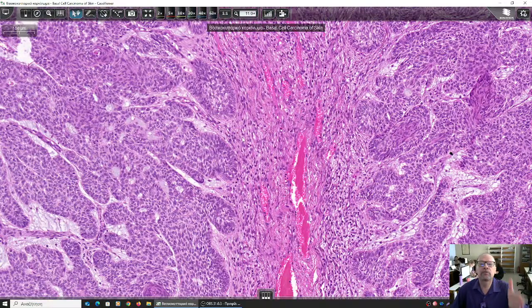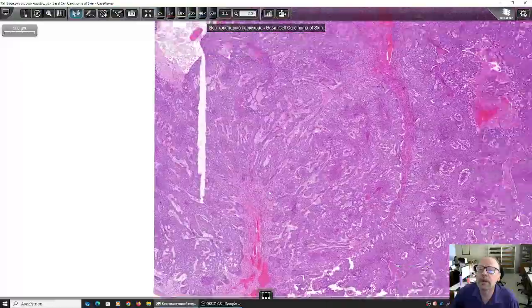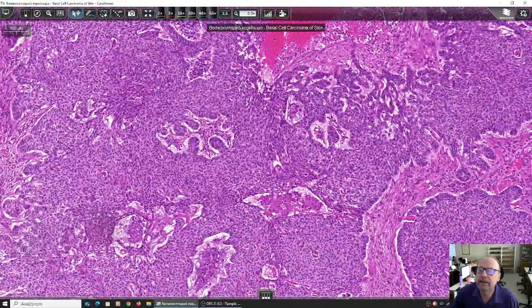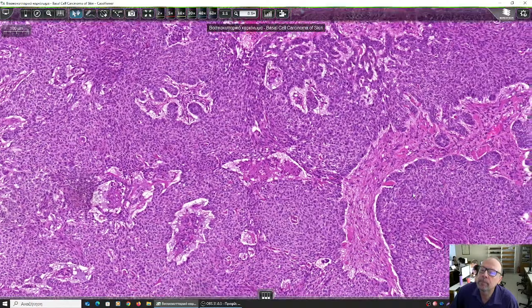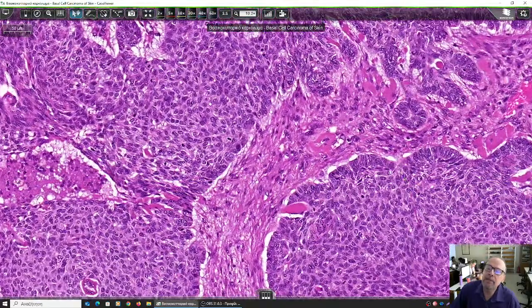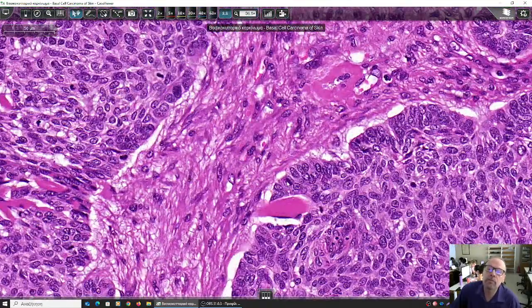They are some sort of stratified, one next to the other. Let me see where I can show that, and it will be clear. You see here? Here they are all mixed. No polarity is evident here, but here they appear to be one next to the other. And what do they do? What is this cell here? In which phase do we find it? This one, this one, this one.